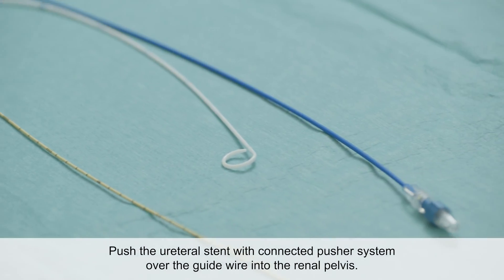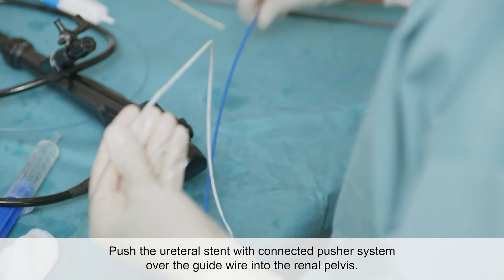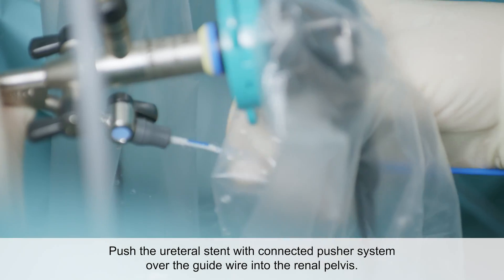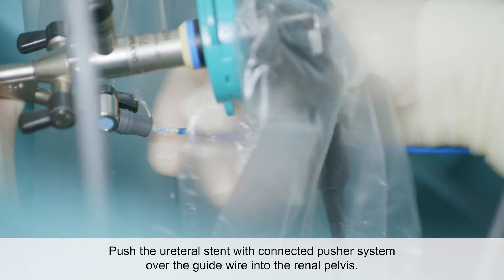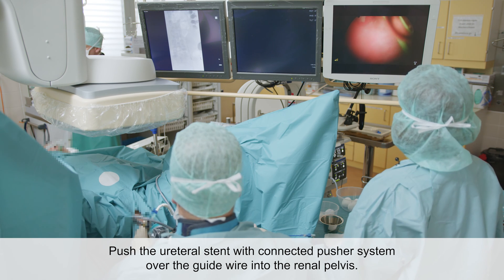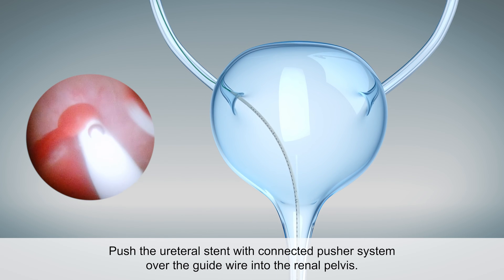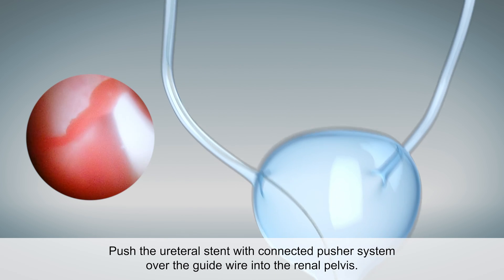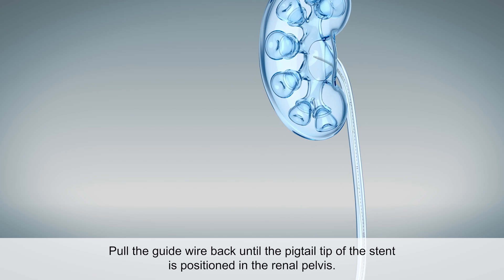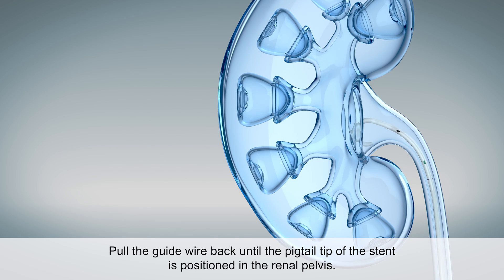The centrally open, steerable Uromed HydroPore ureteral stent is threaded onto and advanced over the wire. The stent is then pushed through the ureter into the renal pelvis and moved into position. The wire is then slightly retracted, so that the pigtail can form inside the renal pelvis.